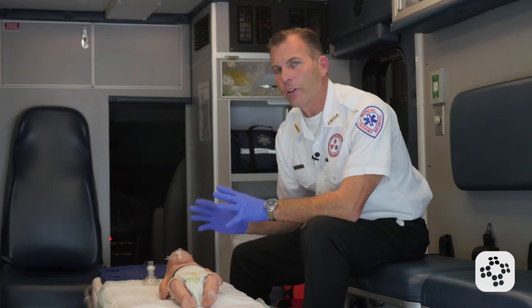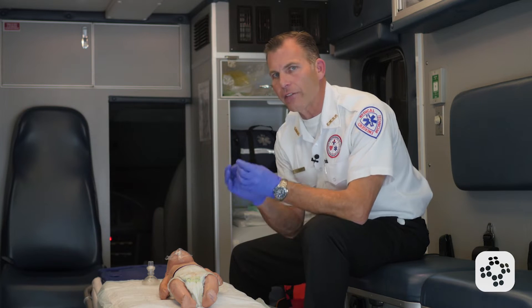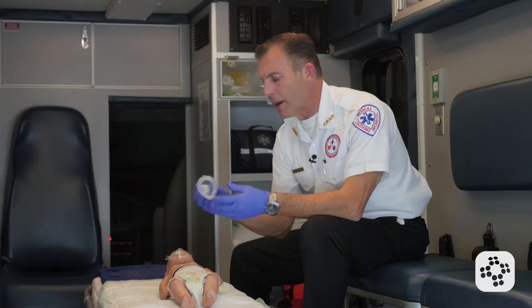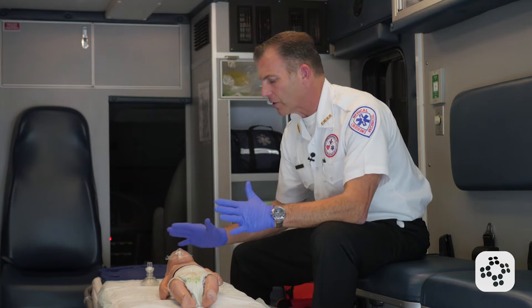In this lesson, we're going to cover infant rescue breathing for the healthcare provider. Our scene is safe, our gloves are on, our rescue mask is available with a one-way valve, and we're going to assess our infant.